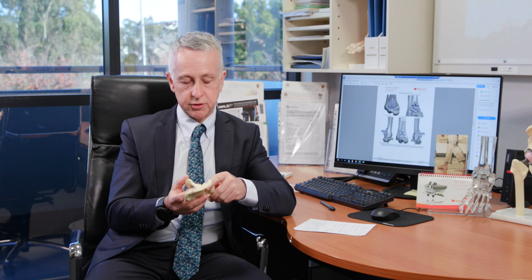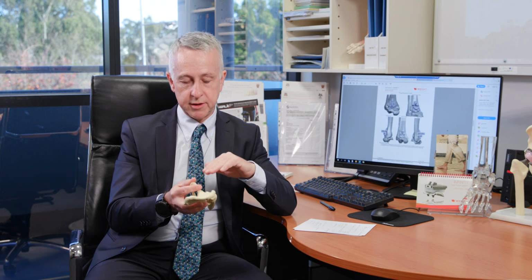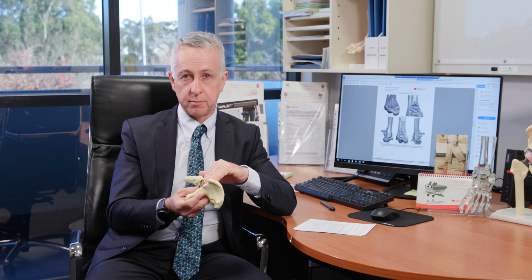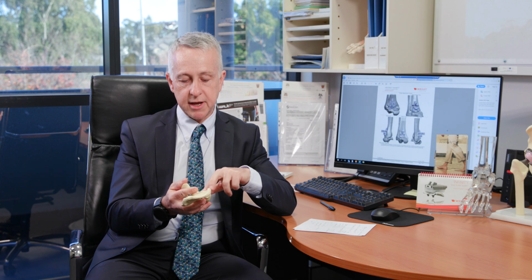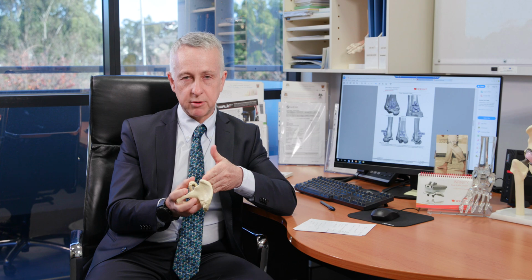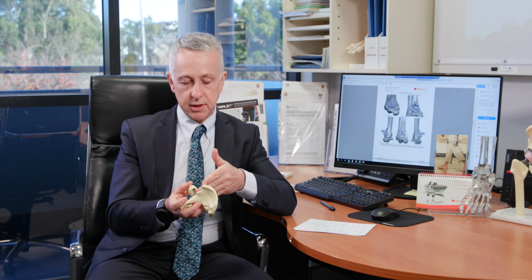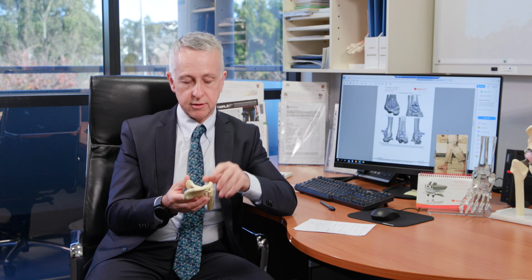So how do we do a hip replacement? There's two different approaches to the hip. You can approach the hip from the posterior, or you can approach it from the front, and there's advantages and disadvantages. My preferred approach is the posterior approach, but a very common approach also is the anterior approach. The advantage of the anterior approach is that it does go between muscles, and there potentially is less soft tissue disturbance. The acetabular preparation is easier, but the femoral preparation is much more difficult with an anterior approach. With the posterior approach, it's the opposite. The acetabular preparation is a little bit more difficult, but the femoral preparation is easier. Either way, at the end of the day, at about 6 weeks, whatever approach you use, if you get the three goals that I talked about correct, then the patient does very, very well.